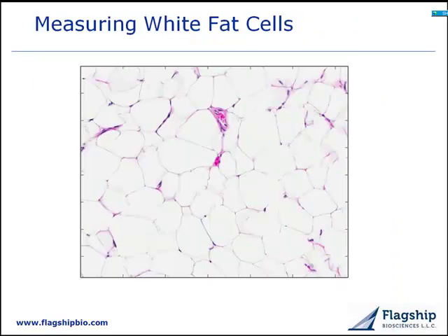Here's white fat. As you can see, it's a collection of globular cells, but many of these cells are not necessarily spherical. When we section through a tissue, it's like sectioning through a basket full of tennis balls — we're cutting through the ends of some balls, which appear as the smaller circles, and sometimes through the maximum diameter, producing larger ones. Not all the spheres are spherical; many are pancake-shaped and packed together with all sorts of odd shapes — a stereological nightmare. What we want is to get an average diameter, average area, or average perimeter of each fat cell to work with those numbers.